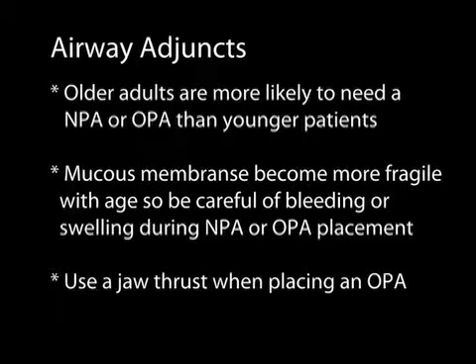Oropharyngeal airways are even more of a challenge because of the bleeding risk. If you insert them backwards and you scrape the top of the hard and soft palate, you can increase the risk of bleeding and the amount of swelling, making it again a crash airway and losing the airway. So be very careful. Always use a jaw thrust or chin lift maneuver when you're placing the oropharyngeal airway to maintain tone of the tongue so that you don't get the tongue caught between the posterior oropharynx and the oropharyngeal airway. Older adults are more likely to need a nasopharyngeal or oropharyngeal airway than younger patients.